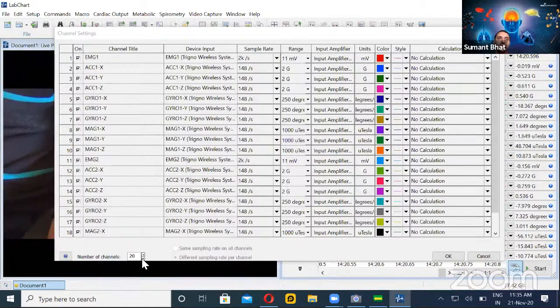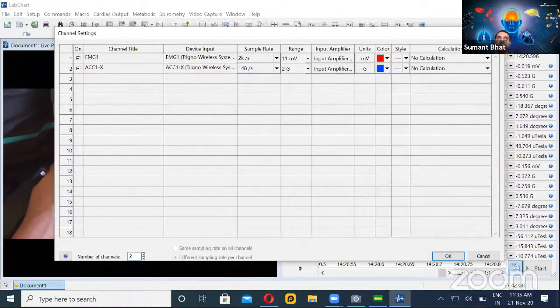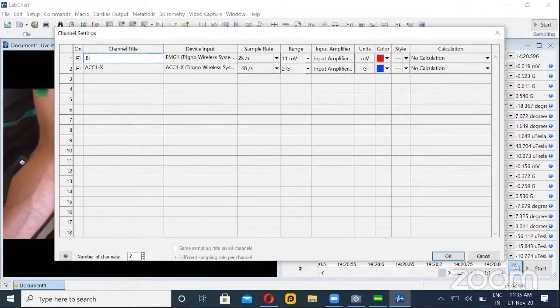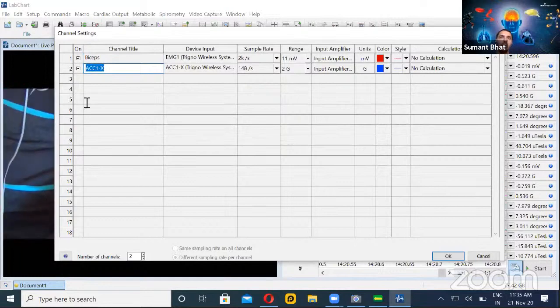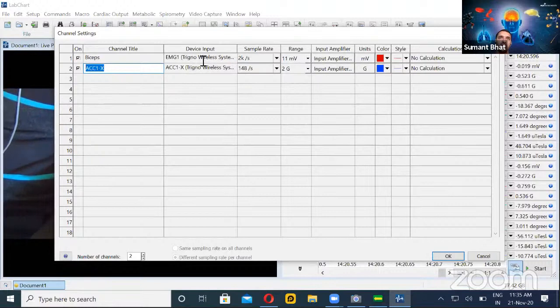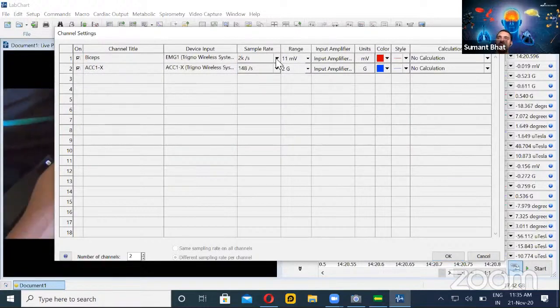It is set to display roughly 20 channels. If you're only interested in two or three channels, you can simply type in the number of channels. If it is a particular muscle, say biceps, you can rename it. You can also see from which device it is taking data and what the sampling rate is. Many people get confused about what sampling rate to use — you can refer to journals and guidelines. EMG is now set at around 2000 samples per second, while the accelerometer is at a lower rate, say 148 samples per second.